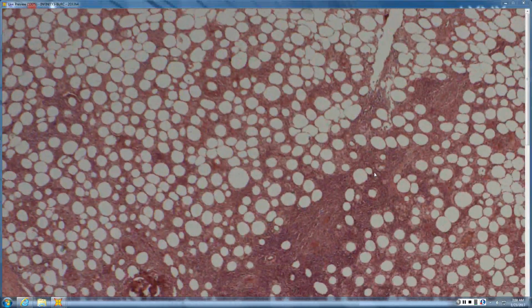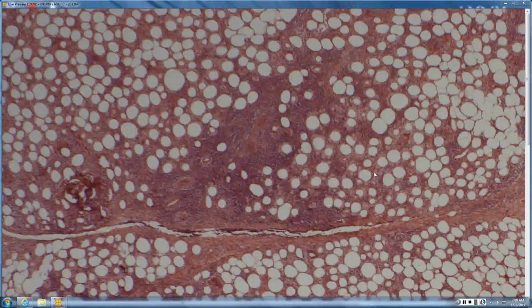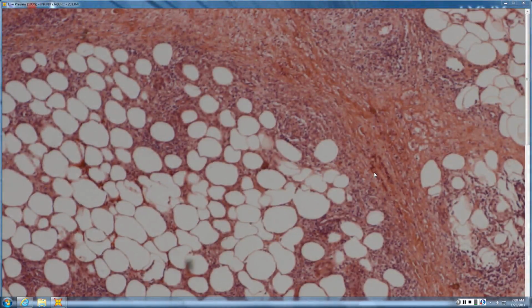And then, looking at scan, okay, we don't have the overlying changes of lupus. We don't have the hyalinization. We have a lobular panniculitis, and then here we have a clue. So does this vessel look healthy? No, right? So there's clearly inflammation and change that's occurred to this sort of medium-sized vessel down in the subcutis. So that's a really helpful clue for thinking about erythema induratum.